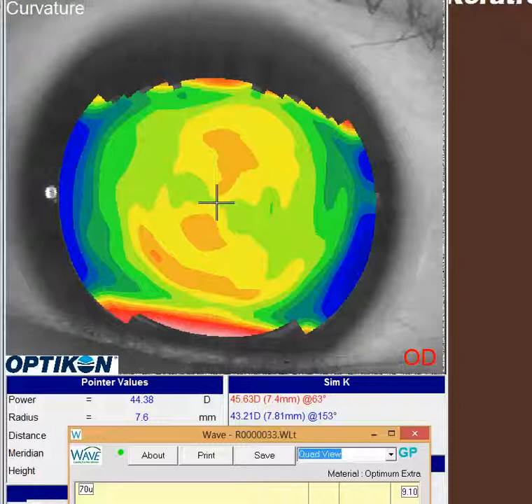But keeping in mind with this patient, I believe, of Asian descent with some potentially tighter lids, that lid-lens interaction may cause that lens to want to either ride along this meridian or this one. So I might recommend that you try to use the shape of that cornea to your advantage and maybe get some back surface toricity on that lens to see if you can mimic that.